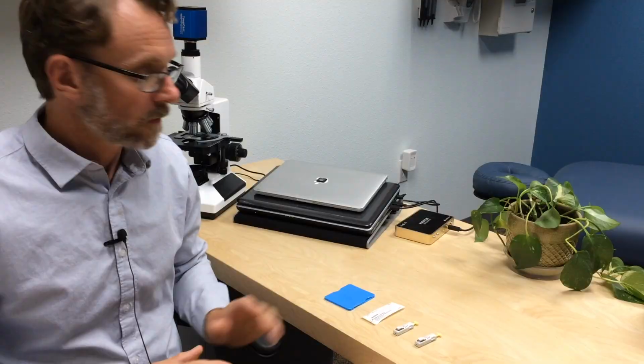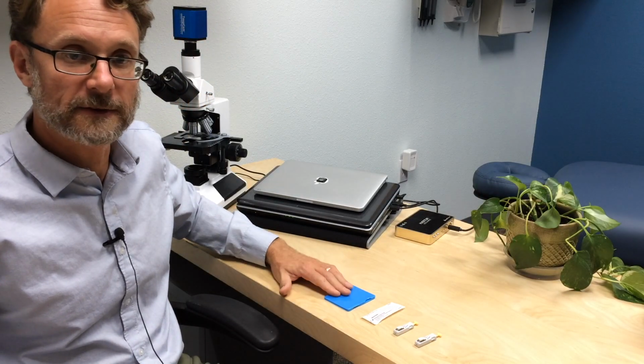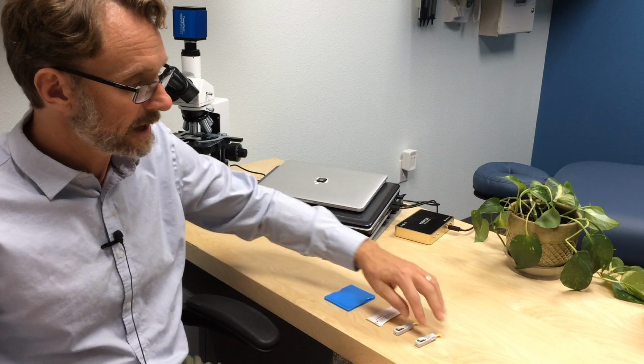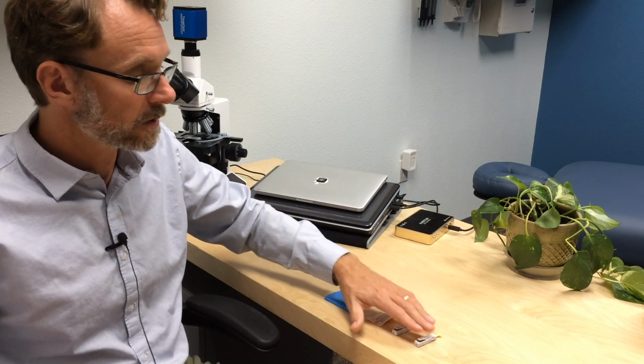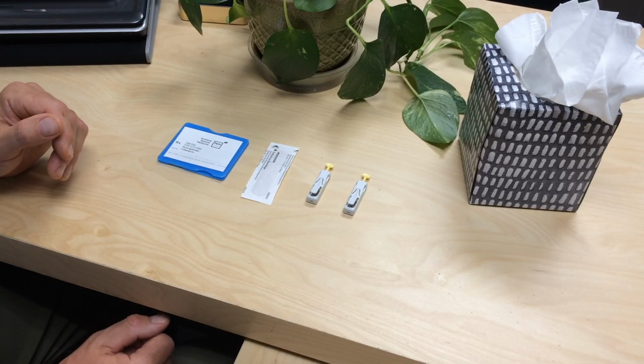Here's our video for a simple home blood collection for shipment to our office. When your package arrives, open it up and there will be 4 things in the package. The first is the microscope slide container, a Band-Aid, and 2 lancets. You're only going to need 1, but we're sending a second one just in case this one fails for some reason. If you're missing any of these items, just give a call to the office and we'll have them shipped to you.